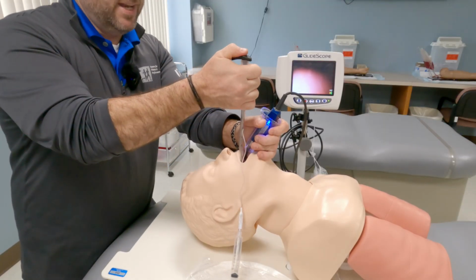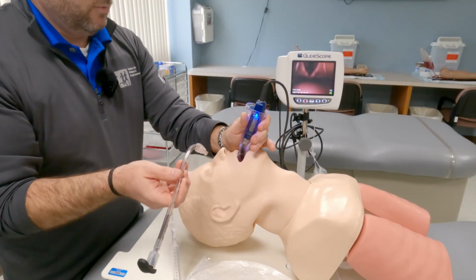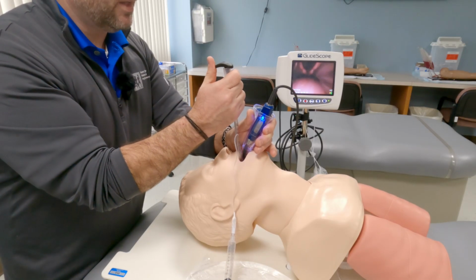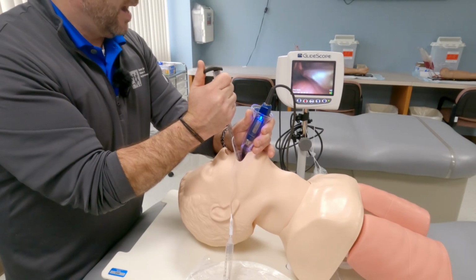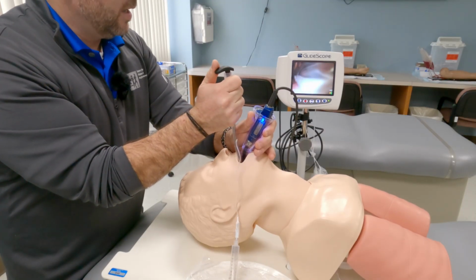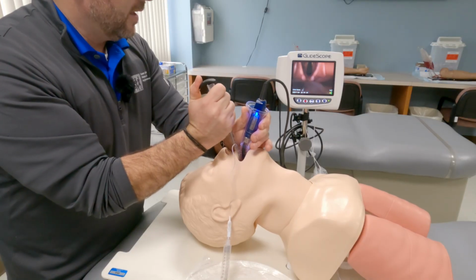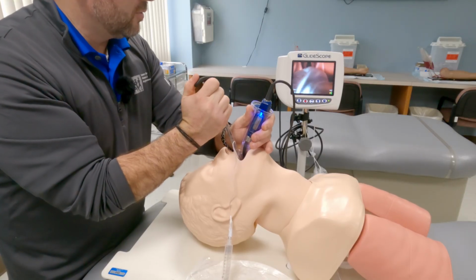It's much more of a finesse that you're going to do when you insert this. So you're going to go in with the blade down the center. You're going to rotate in. You're going to go up to the joystick, okay? Now, watch my thumb up here manipulating the joystick. If I'm down here, I'm going to push this way, and it moves it. You see it moves back and forth in here. You're going to use that manipulation of this joystick to get it to go to the right spot.